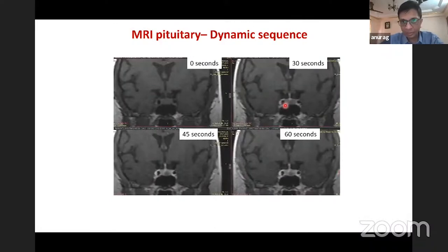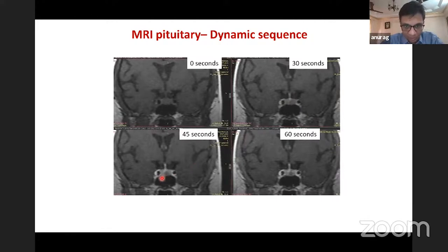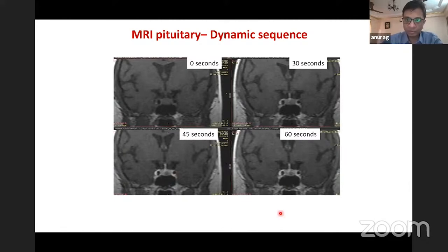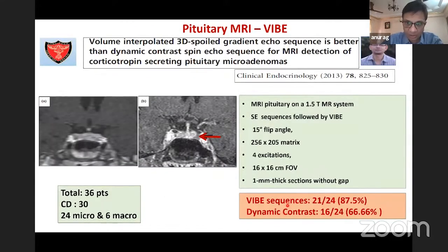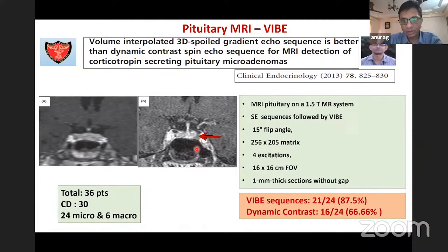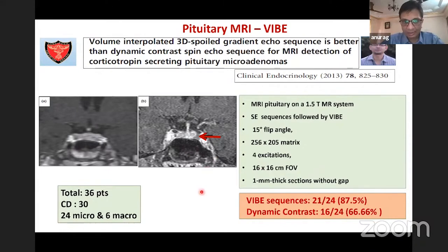Dynamic contrast is required for Cushing's microadenomas. At 30 seconds, normal pituitary enhances first; later the lateral pituitary enhances, and the adenoma is last to enhance — this differential enhancement is used in dynamic sequences. We have also added a VIBE or SPGR sequence, and its sensitivity is higher than dynamic contrast in our experience. However, false positives can occur and the protocol must be well defined.